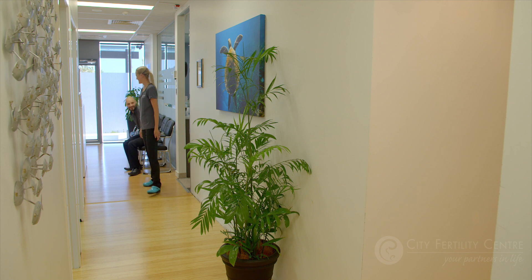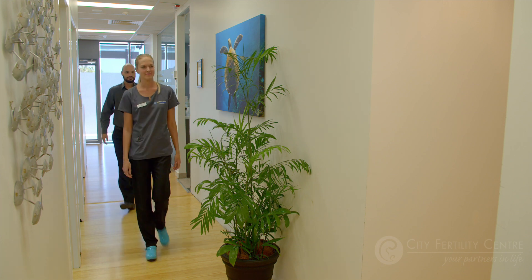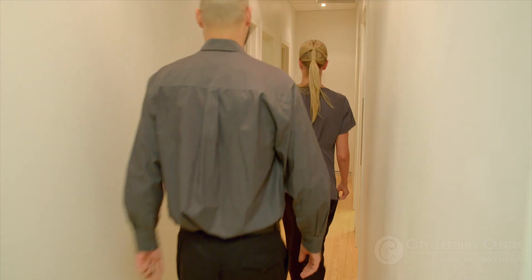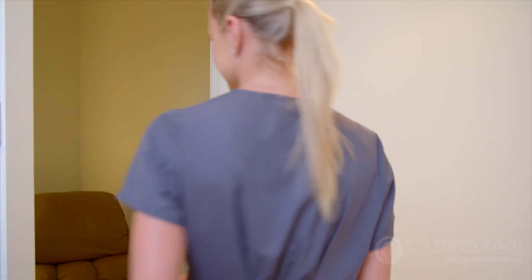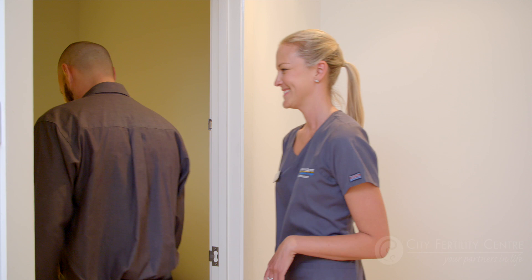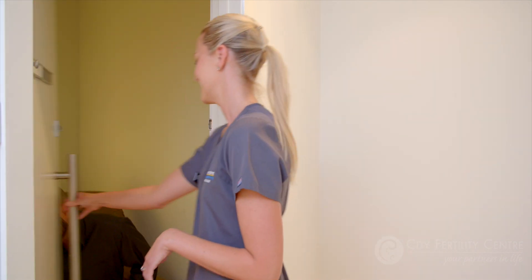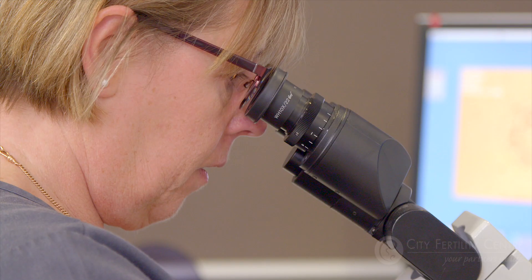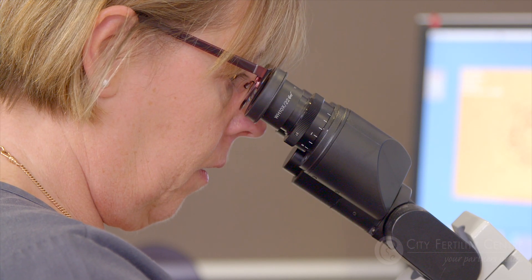On the day that you are due to provide your sperm sample, you are allowed to collect the sample in a private room at the CFC clinic, or you can do it at home. If you collect the sample at home, you must have it to the clinic within an hour. Once the embryologist receives your sperm sample, they will analyse and prepare it for insemination.